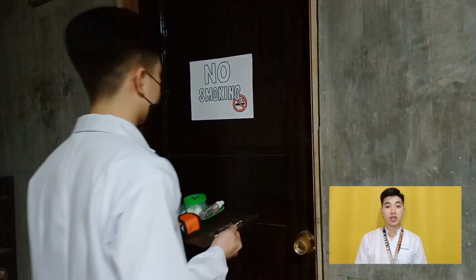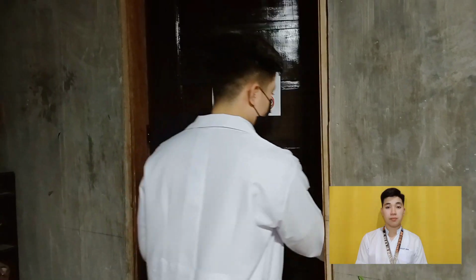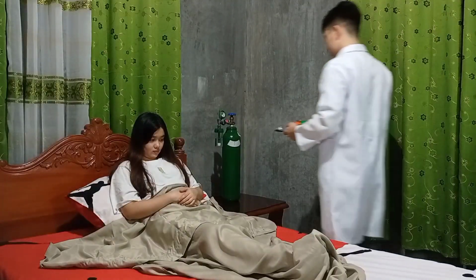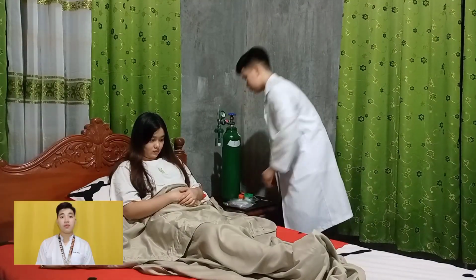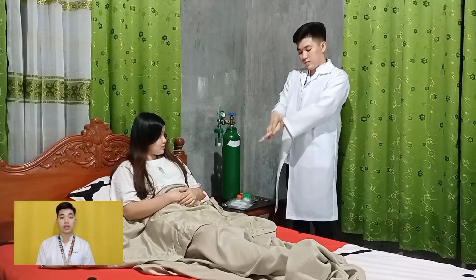For the implementation, bring necessary equipment to the bedside stand or overbed table. Then perform hand hygiene and put on PPE if indicated. Identify the patient. Then close curtains around bed and close the door to the room if possible. Explain what you are going to do and the reason for doing it to the patient.